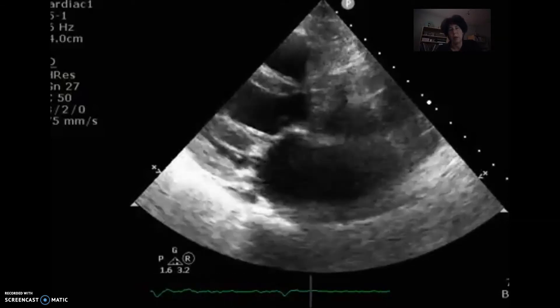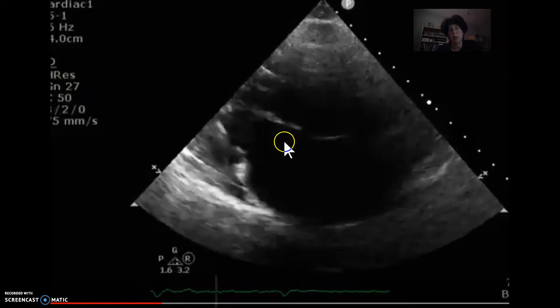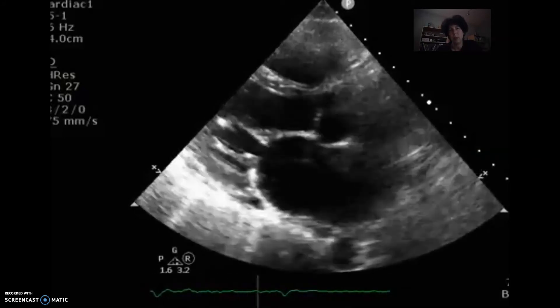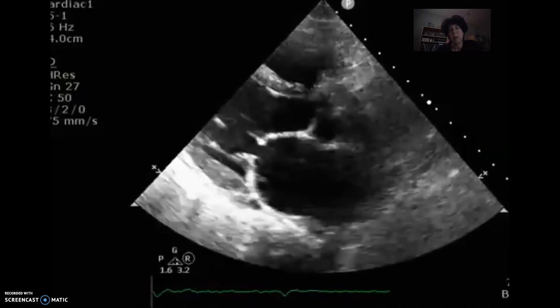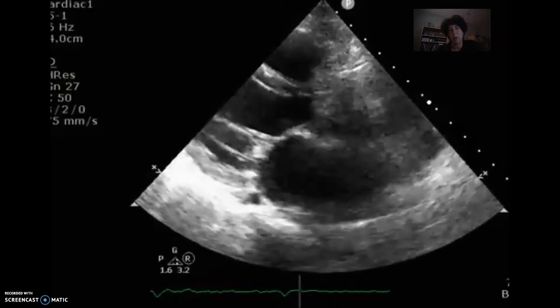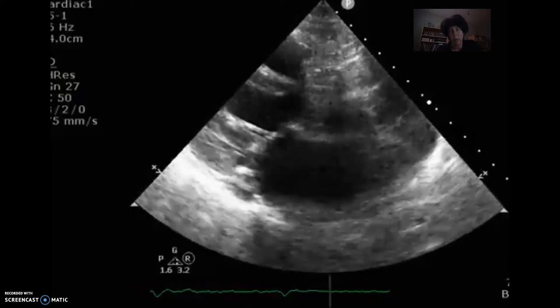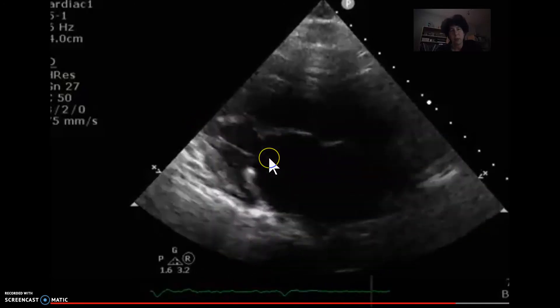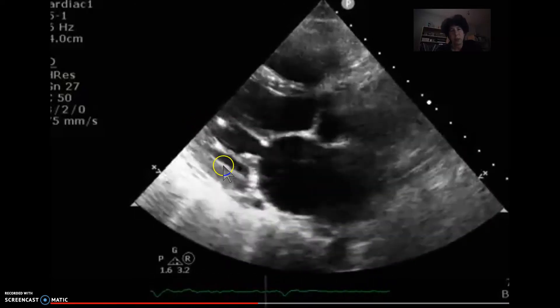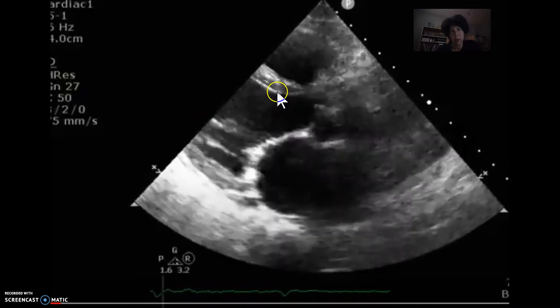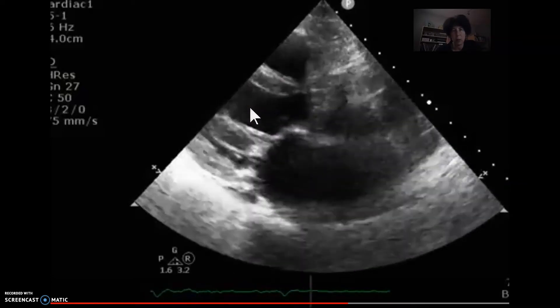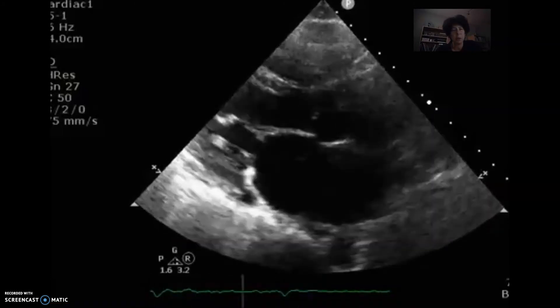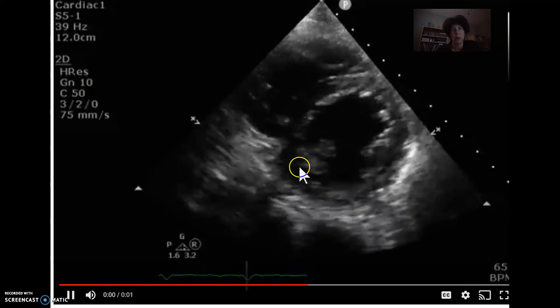In FOCUS, you can't really distinguish between mitral stenosis and low flow very easily other than looking visually at the valve to see if it's normal. In more advanced echo, we would put a gradient through the valve to see if there was decreased flow — a delay in pressure half-time — which would imply mitral stenosis. So we can see a large left atrium, possibly a low flow state. The ventricle appears to be thickening, and the RV peers in and out. The main finding I'm getting from this view is a large left atrium.